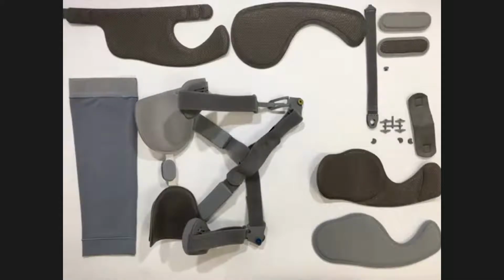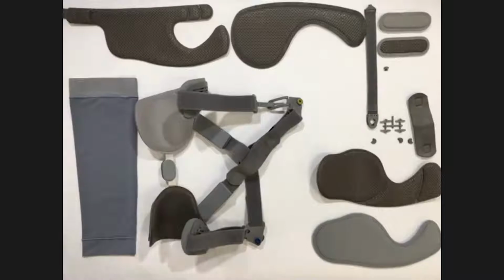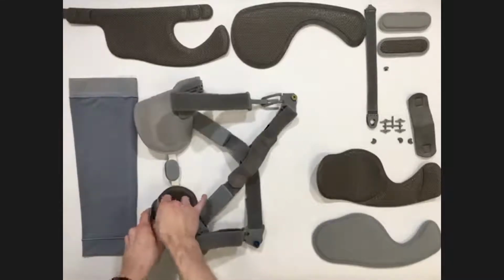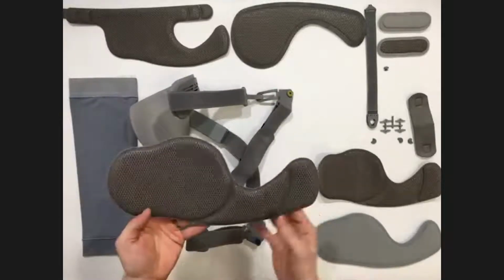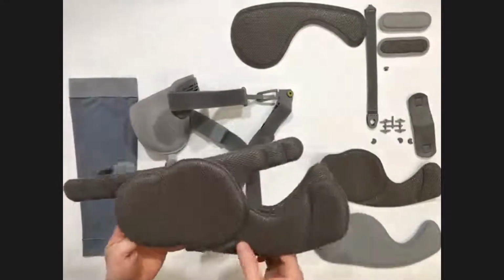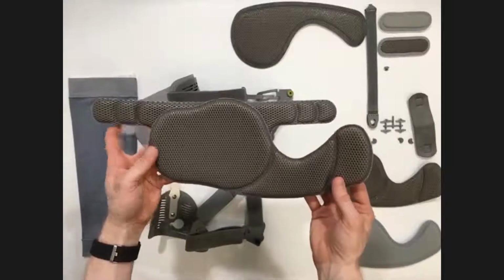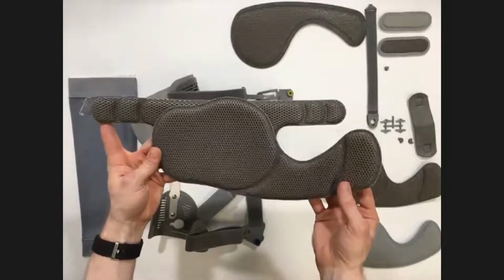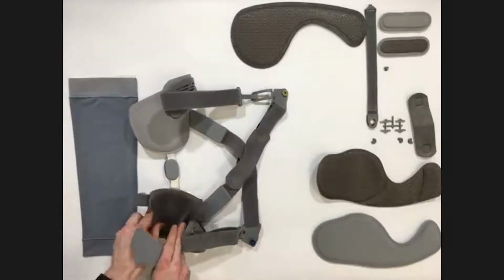So what I'm going to do first of all is talk about some of the different options if you're getting migration. So starting at the top with the AMS system wrap, or anti-migration system wrap. So this one actually replaces the tibial liner. So as I remove the tibial liner here, I can replace that with the AMS wrap. You can see that this is a very similar shape to that, but it incorporates a gastroc strap.